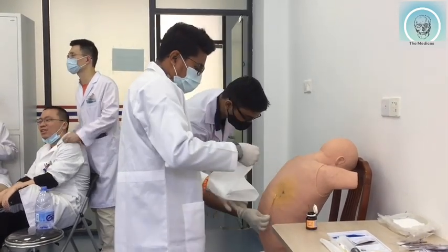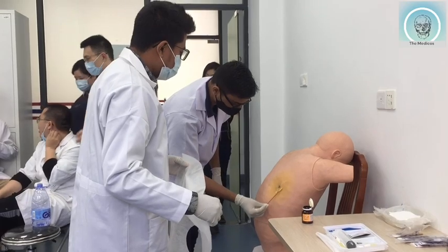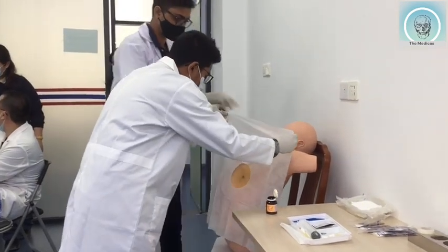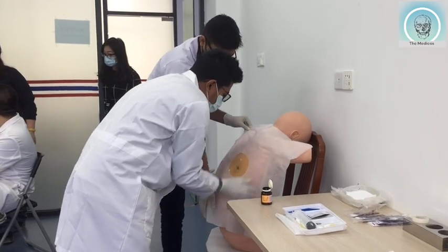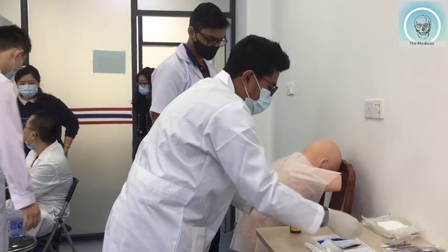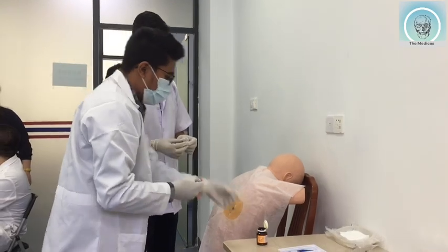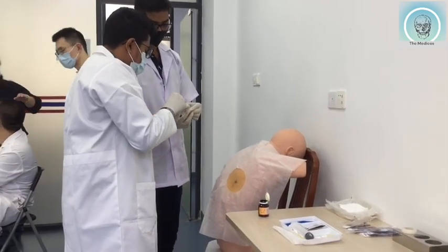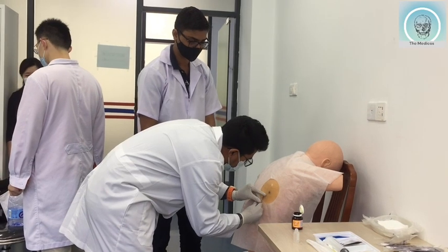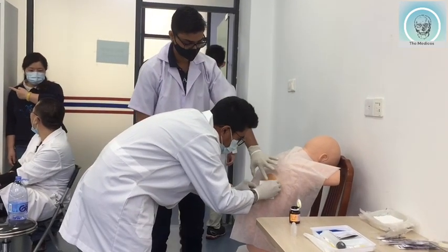A pleural effusion may be detected during a physical examination or by diagnostic studies that create an image of the chest, such as a chest X-ray, chest CT scan, or chest ultrasound. The main reasons to perform a thoracentesis are to determine the cause of the pleural fluid and to relieve the shortness of breath by removing the fluid. A diagnostic thoracentesis is performed by removing a small sample of pleural fluid, like 60 ml, to determine the cause of a pleural effusion and to help doctors select the best treatment. And a therapeutic thoracentesis is used to remove a large volume of pleural fluid, about 600 ml to 1200 ml, to relieve symptoms such as shortness of breath.